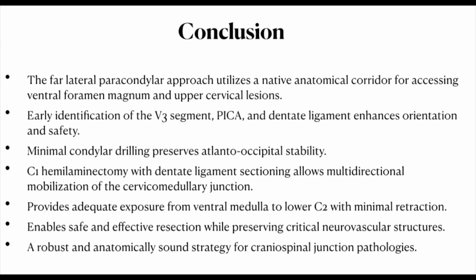In conclusion, the far-lateral paracondylar approach offers a strategically favorable and anatomically sound corridor for microsurgical resections of lesions extending from ventral medulla till the lower segment of C2. This operative video underscores the efficacy of this approach in achieving a broad surgical corridor through limited condylar drilling, C1 hemilaminectomy, and sectioning of the dentate ligament.